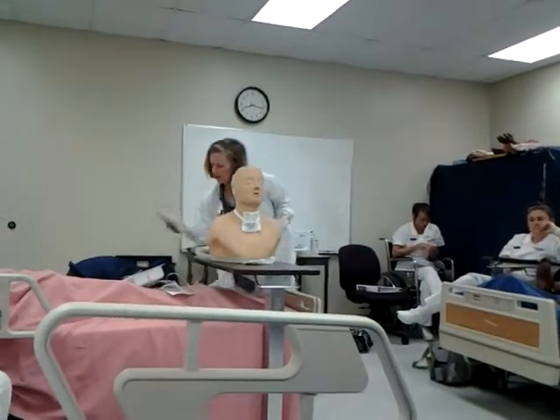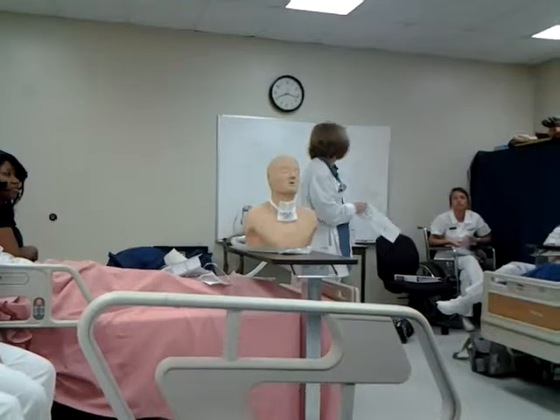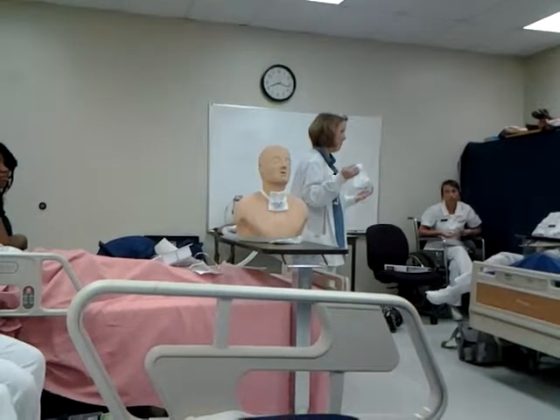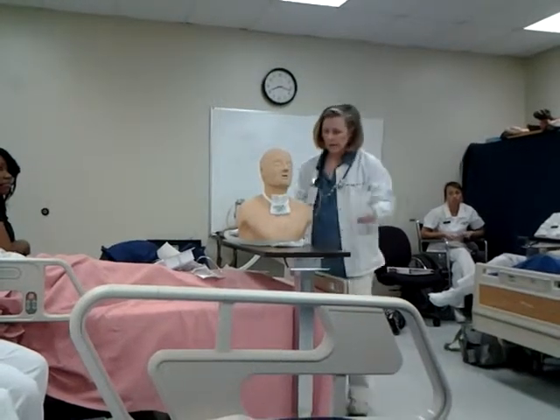The nurse is gonna look at me like I'm crazy when I ask somebody to come in to help me with trach care. I know in the book it says you should have a second person holding the collar in place, the neck piece in place while you're cleaning it so it doesn't move. You should have a second person holding, to stabilize that.